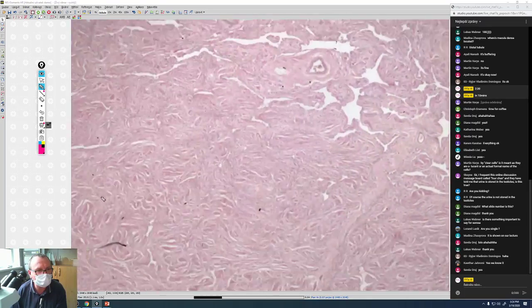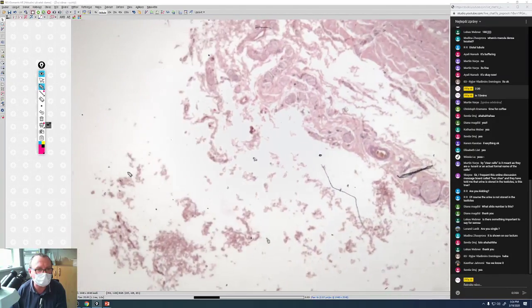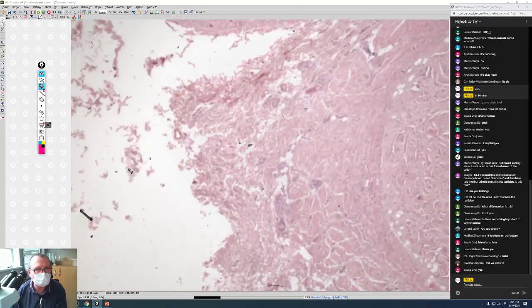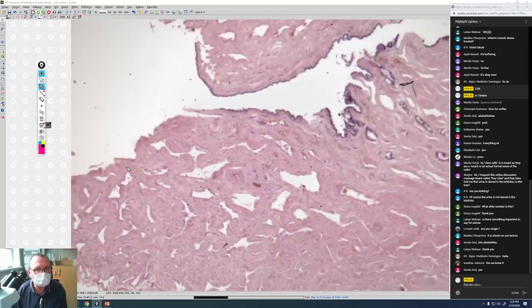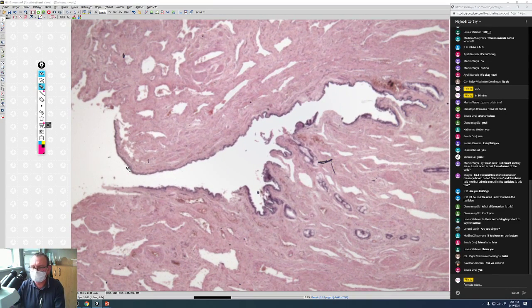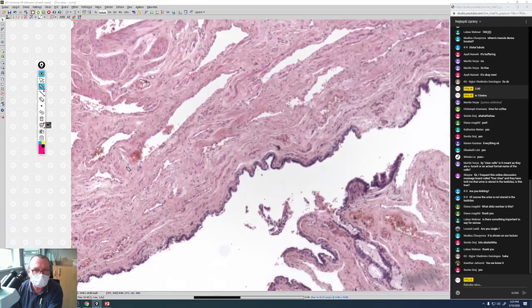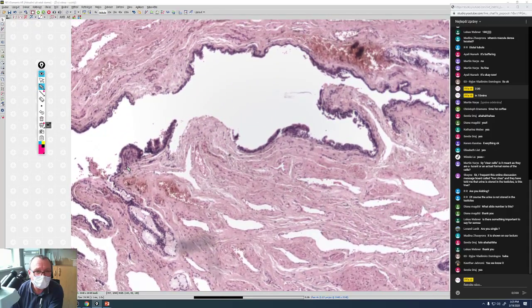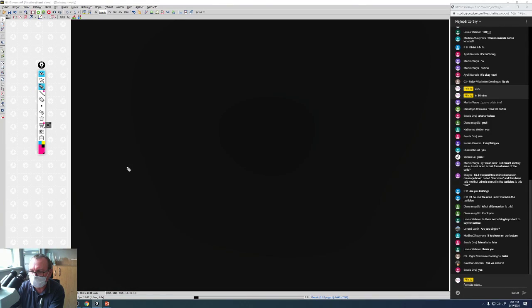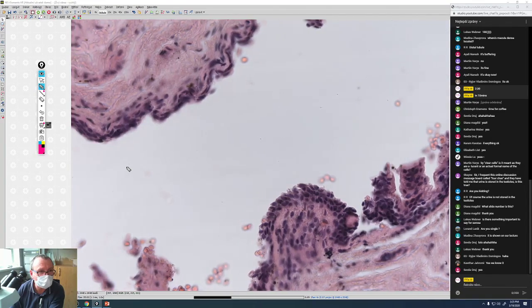Again, no skin is on the surface, just some subcutaneous tissue and cavernous bodies. And here, terribly damaged, is a part of the urethra, where there is stratified squamous epithelium. I hope that I'll find some segment where I can really show that this epithelium is squamous.